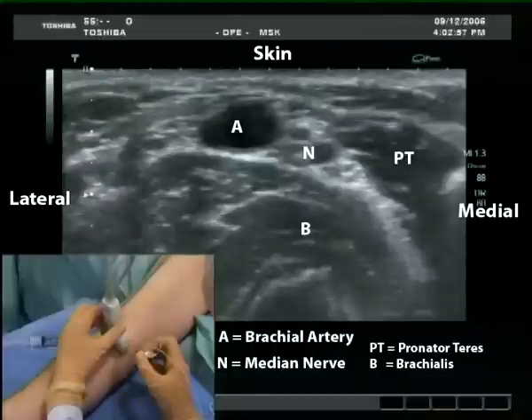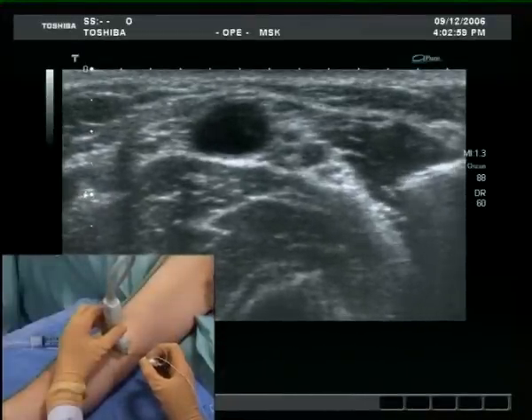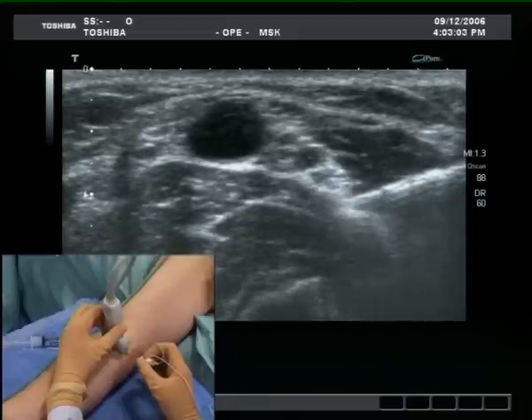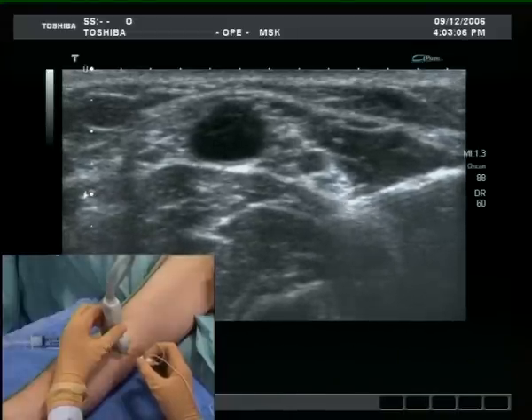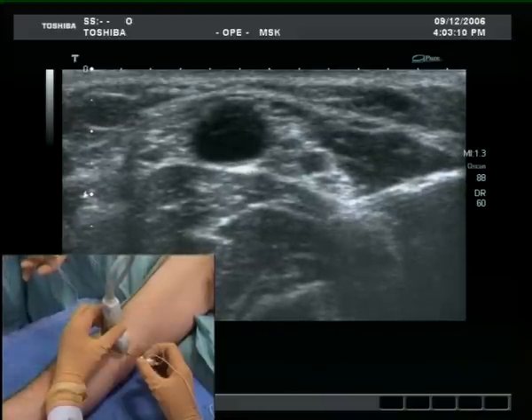The needle appears from the right side of the image. The aim is to place the tip between the fascias of the pronator teres and brachialis muscles. Needle tip contact with the nerve is not necessary, as the injection of some local anaesthetic will open up a space for safe, controlled needle advancement.